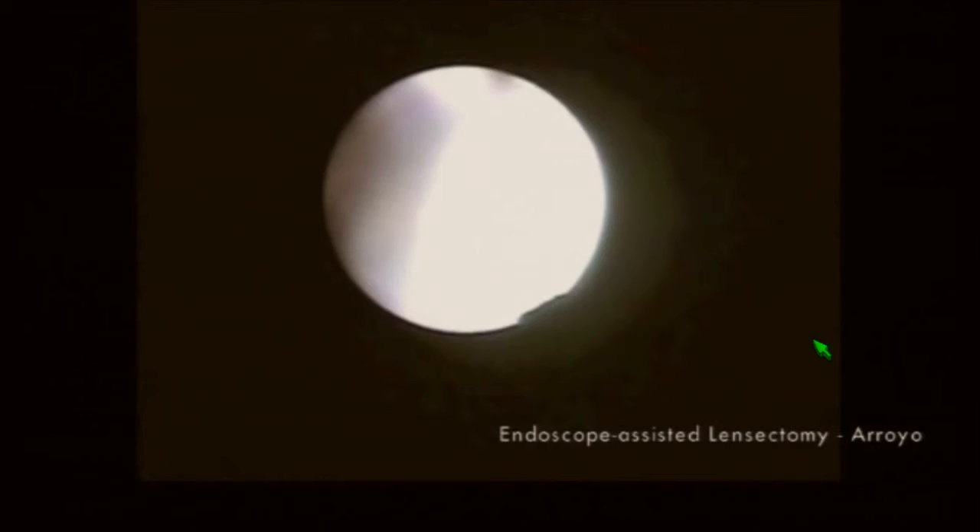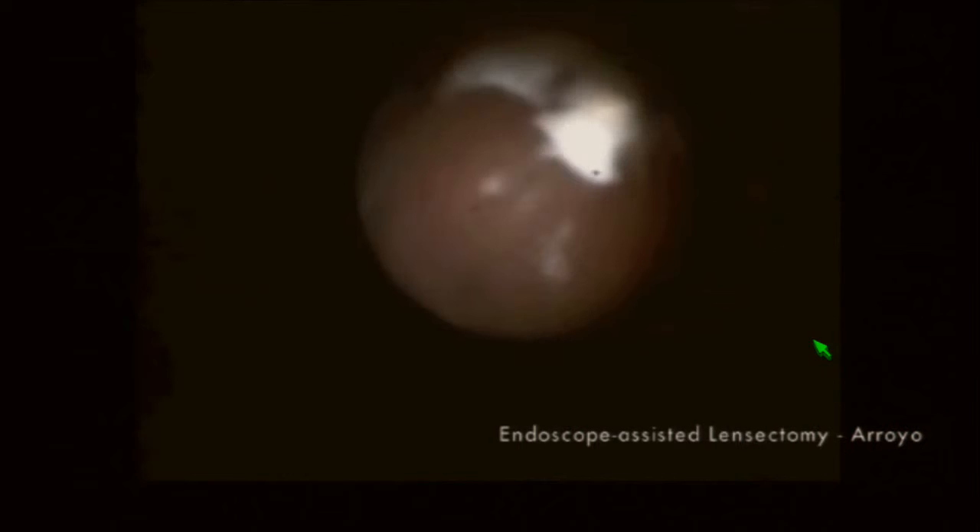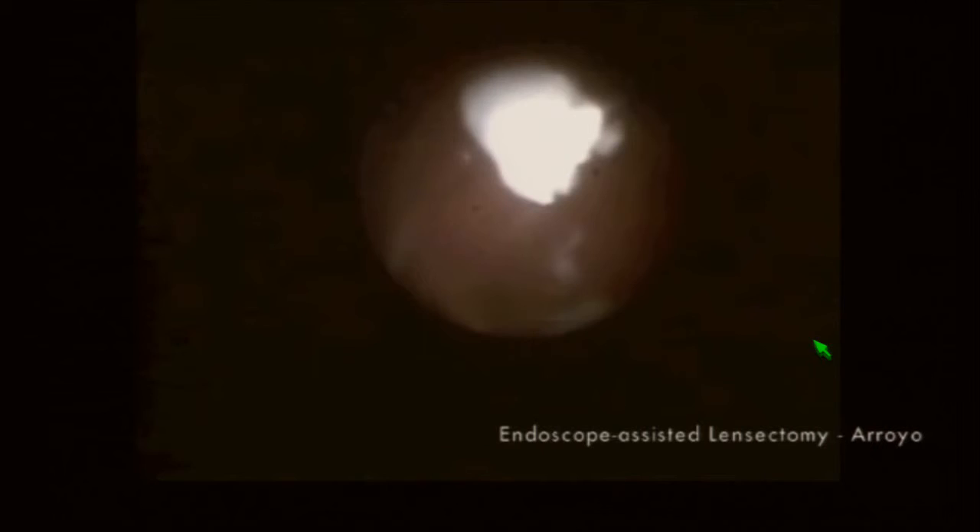For instance, we're able to do intracapsular pars plana lensectomy, as seen here, or intravitreal pars plana lensectomy, as seen here. The endoscope is particularly helpful in identifying and removing small, hidden fragments of lens material at the vitreous base.